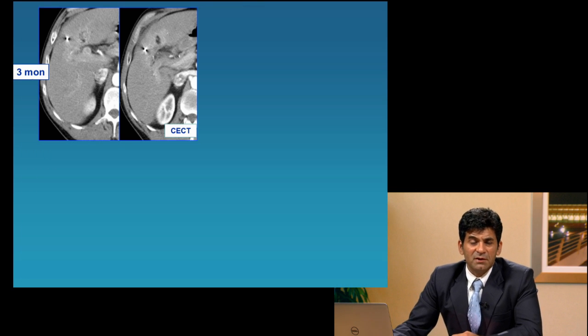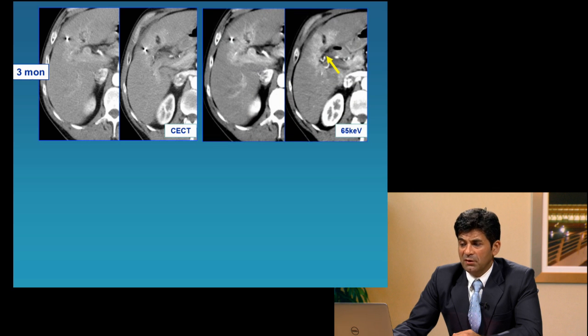Patients who have been treated with targeted radiotherapies are another challenge we are confronting on conventional CT. The determination of the true extent of the lesion as well as the treated zone remains difficult, given the similar enhancement and attenuation with the normal parenchyma.